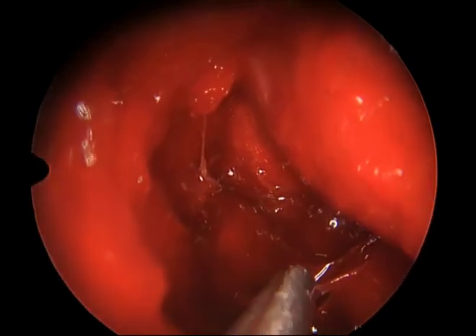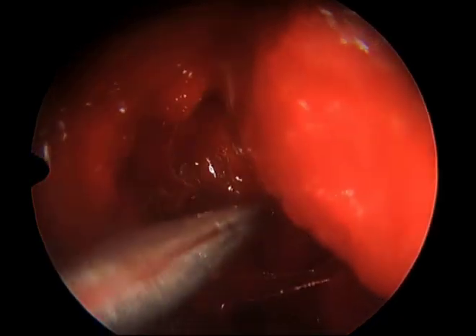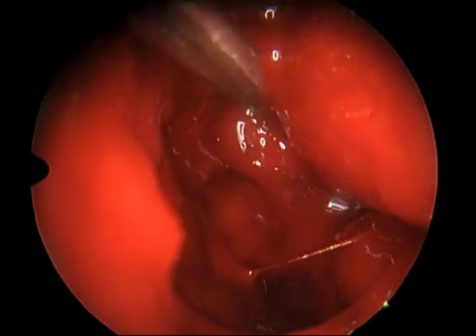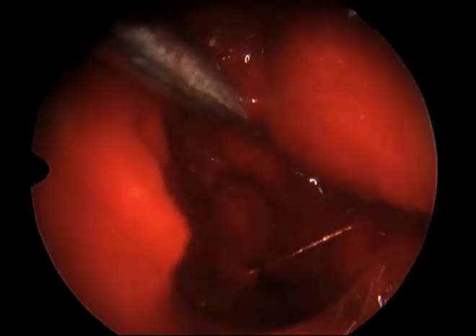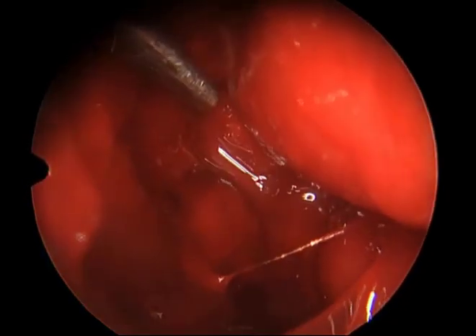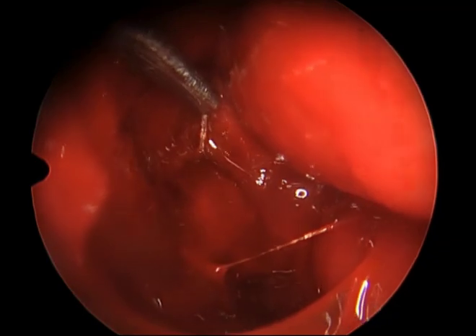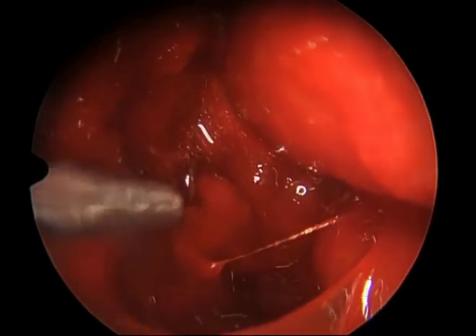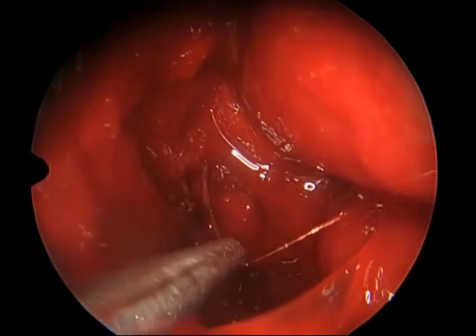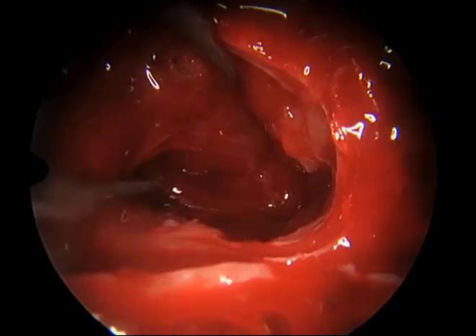The diaphragm is there on the right side of the screen, and the lateral aspect, or the wall of the cavernous sinus, is on the left. We can visualize whether or not there is any persistent tumor and ensure that we are able to get a gross total resection.